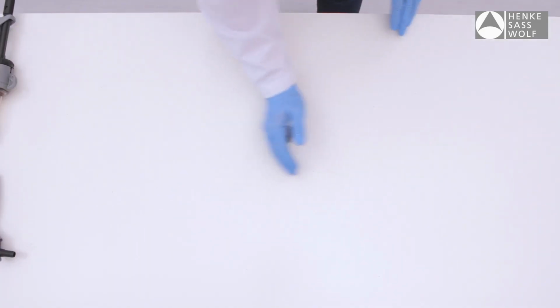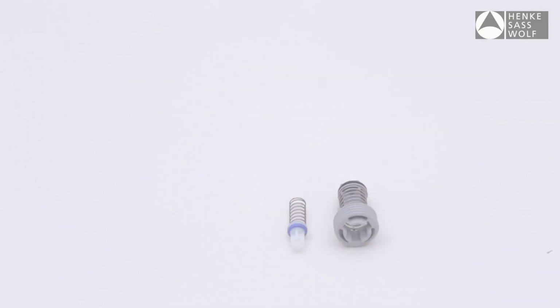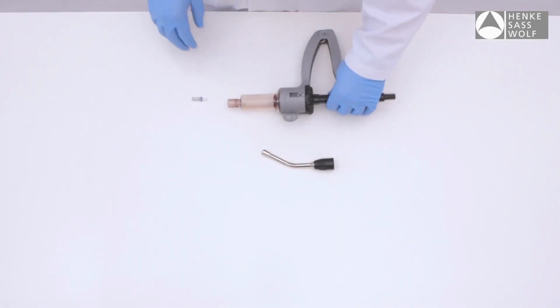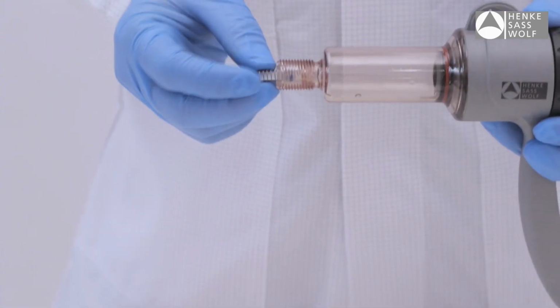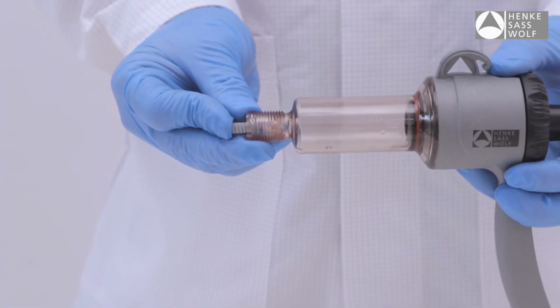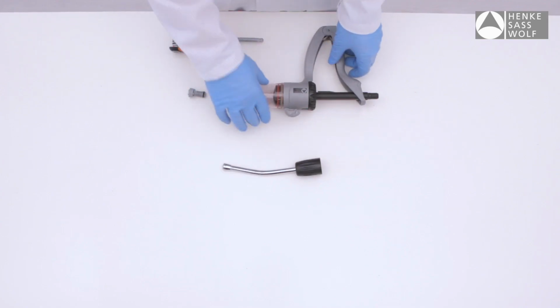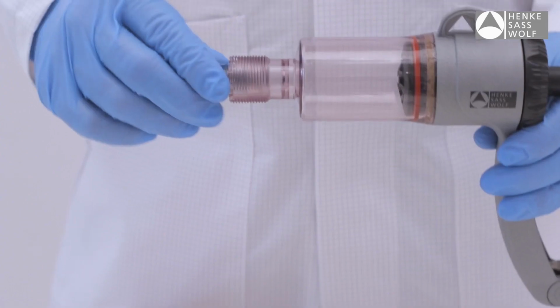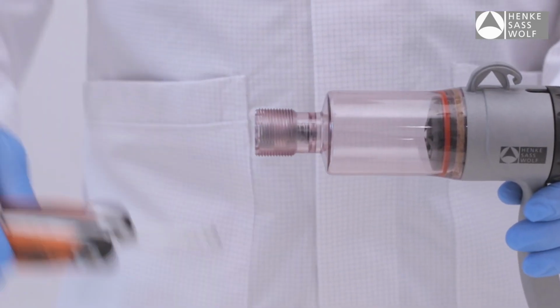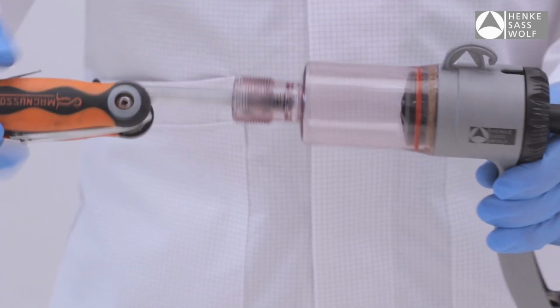If necessary, change or clean the valve with spring and O-ring. For HSW Eco Matic Drencher with 12.5 ml and 30 ml volume, put the valve including spring and O-ring into the barrel and let it click into place against a little resistance. For HSW Eco Matic with 70 ml volume, put the valve including spring and O-ring from the front into the barrel and fix it by screwing the valve safety screw.